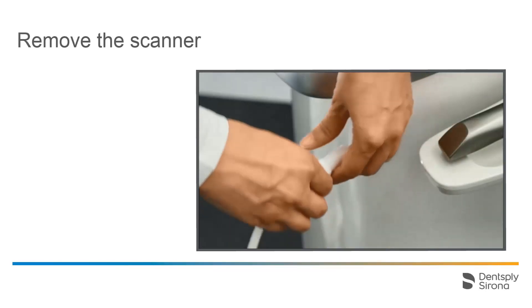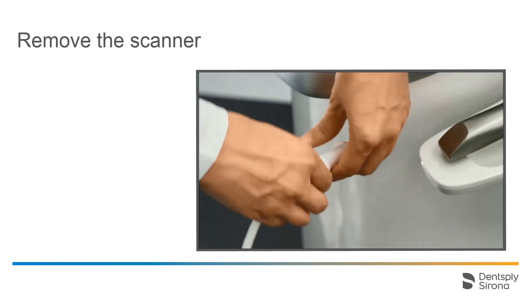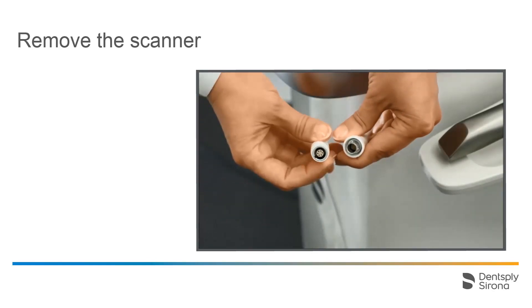The scanner is attached to the Acquisition Center with a plug connection. To release it, hold both parts of the assembly tightly and pull them straight apart. To reassemble them, make sure that the guiding lugs engage with each other.